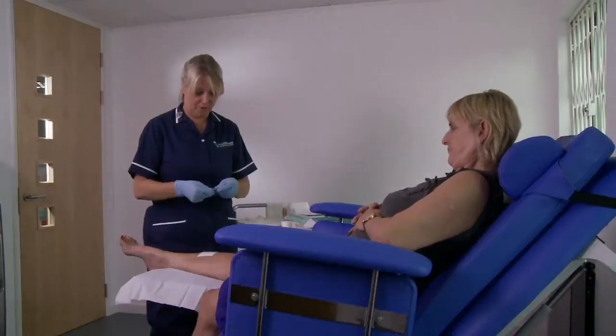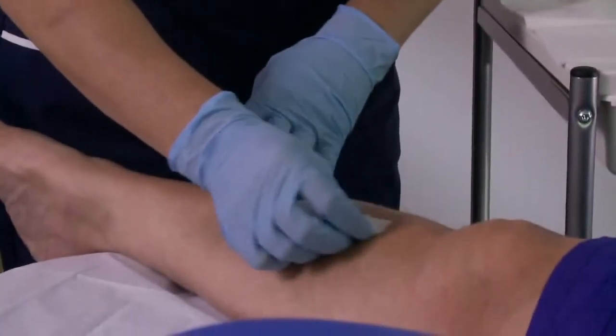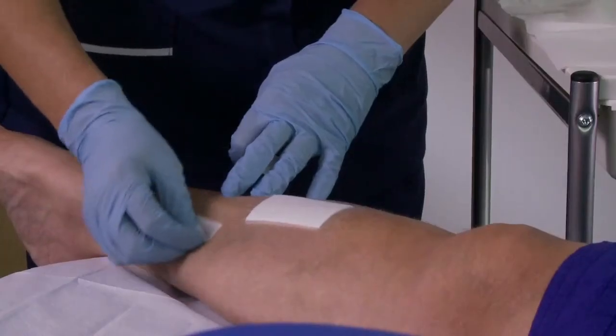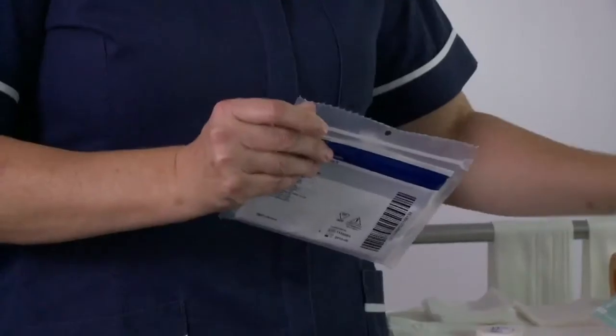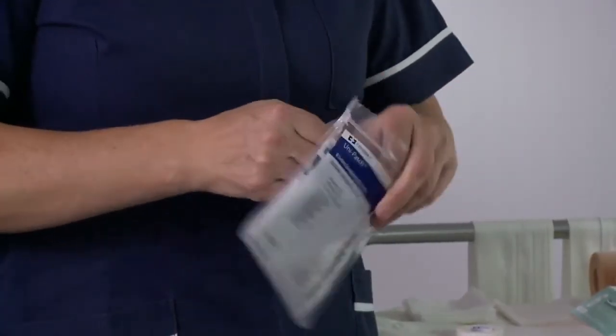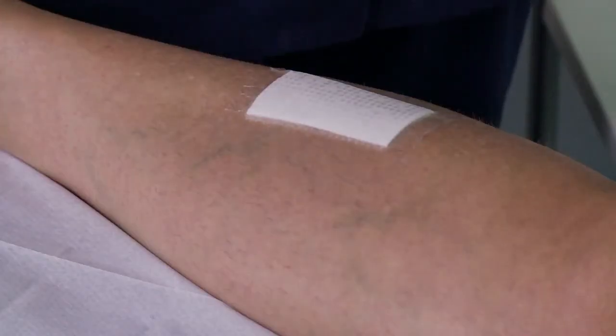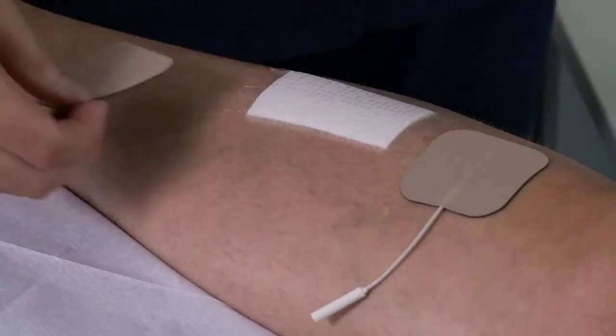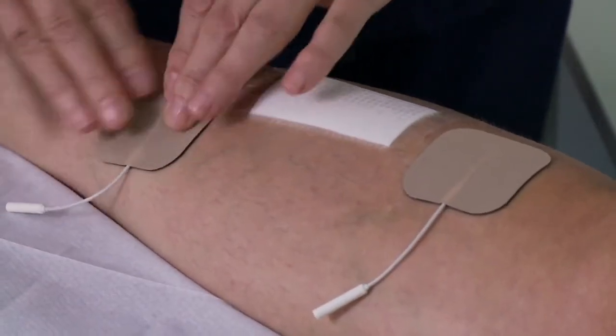It is important to apply Axel Heal's electrode pads prior to applying any emollient. The selected areas need to be cleaned with the wipes provided within the treatment pack. The electrode pads need to be placed as close as possible to the wound site on healthy skin either side of the wound, ensuring that the pads are applied outside of the area covered with the primary dressing.